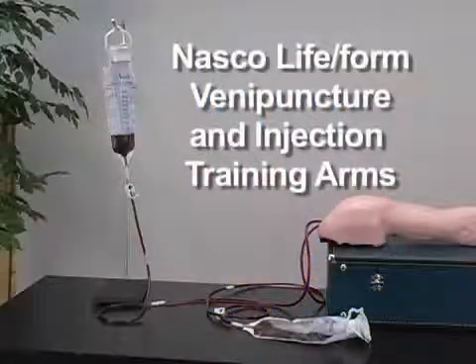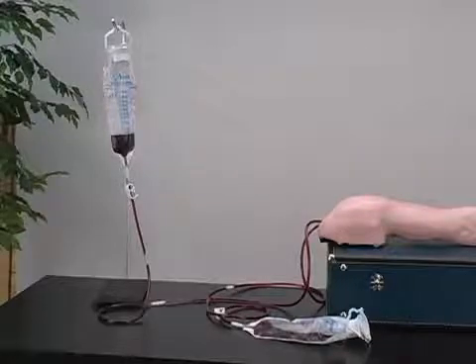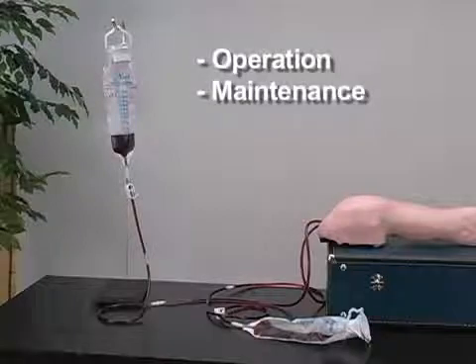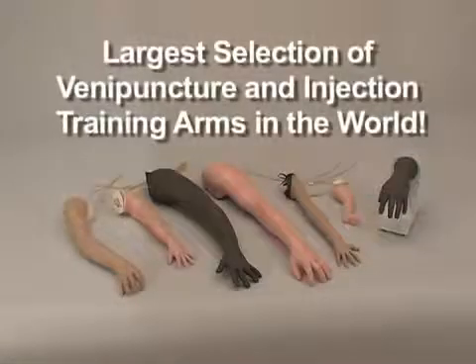Welcome to the video guide for our NASCO Lifeform Venipuncture and Injection Training Arms. This video will teach you the proper operation, maintenance, and tips and troubleshooting for our complete range of training arms. NASCO offers the largest selection of venipuncture and injection training arms in the world.